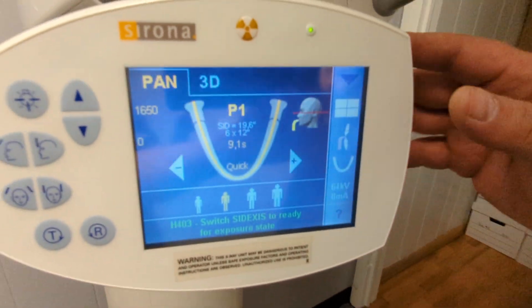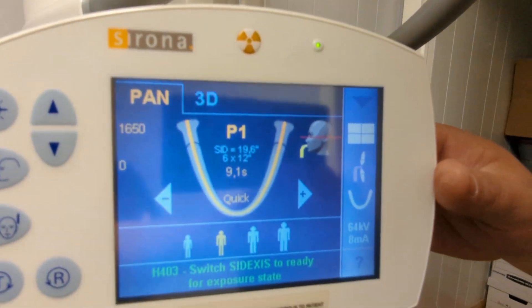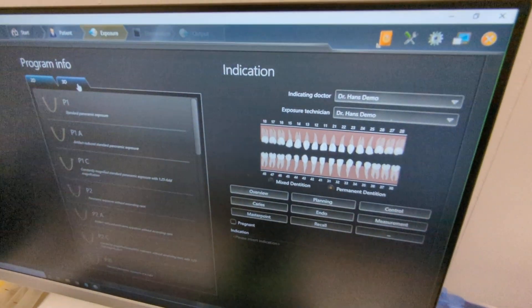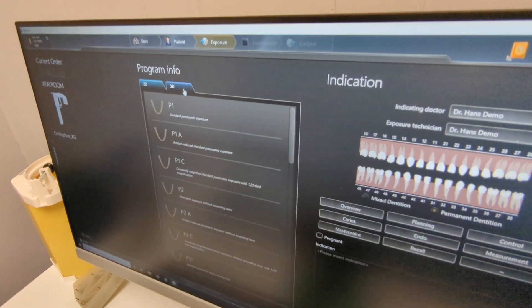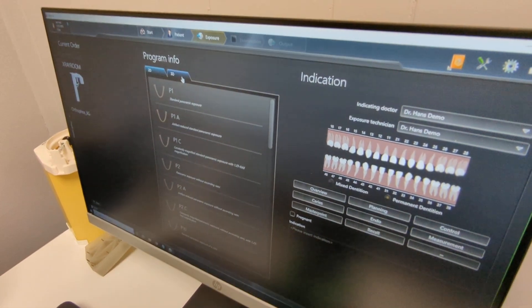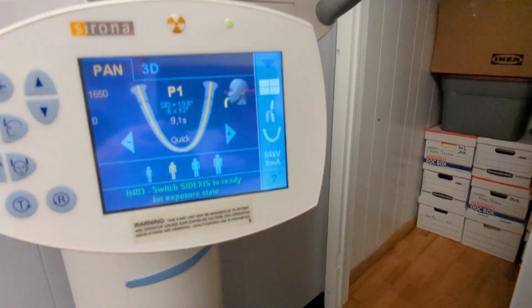We're talking about having printed sheets that map out each step. So: P1, get your patient in, hit Next. On panorexes you're going to be in EagleSoft. For 3D you're going to be in this program. We'll cut for now — we're good.